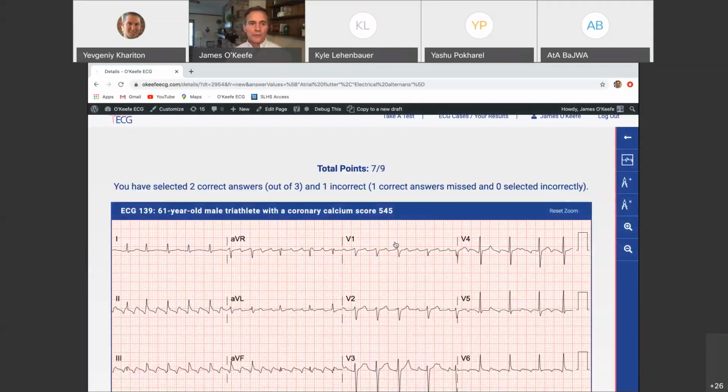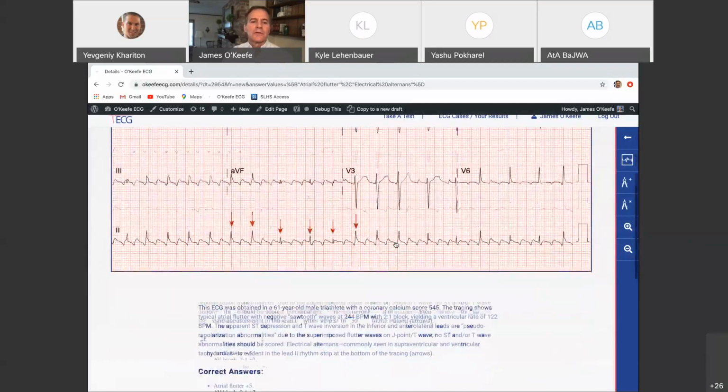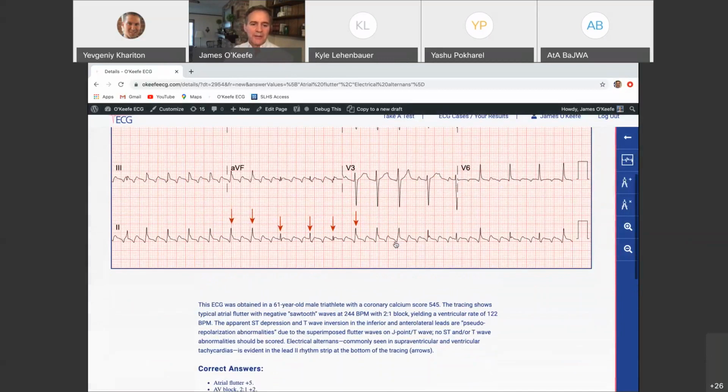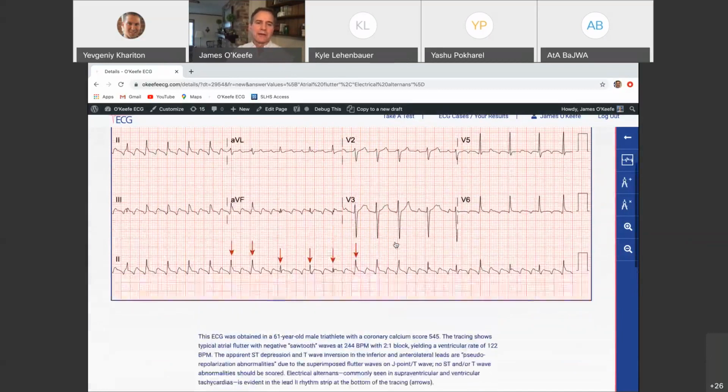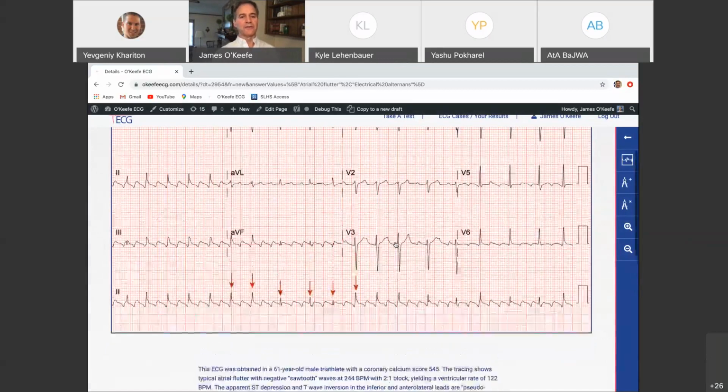Any question? Let's see. Atrial flutter. Oh yeah, the 2-to-1 block. I'm sorry, we talked about that, but that's another important point to keep in mind. When you see a flutter at 140, 150 beats a minute, double check that, because it's usually 2-to-1 AV block at that rate, and there is.